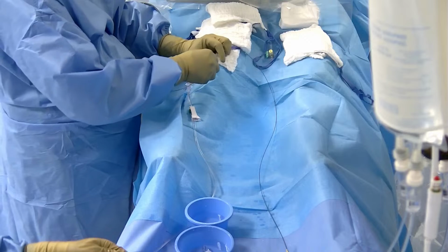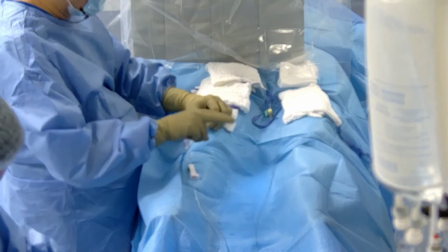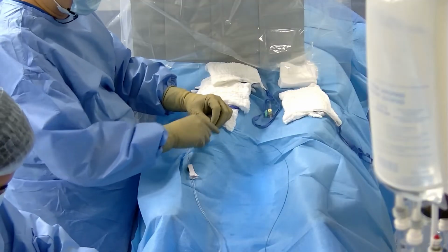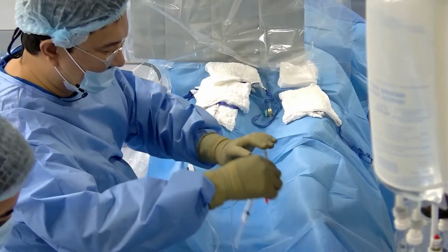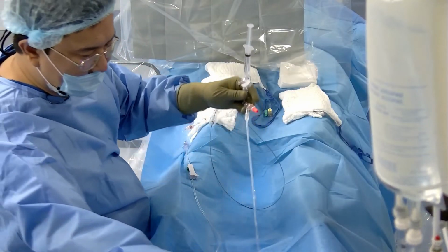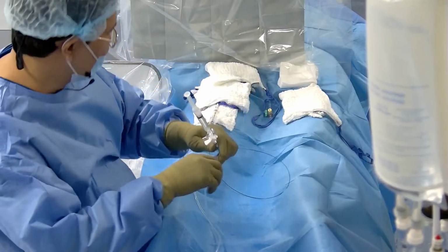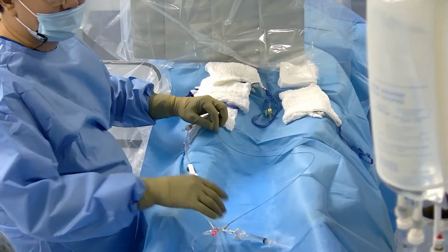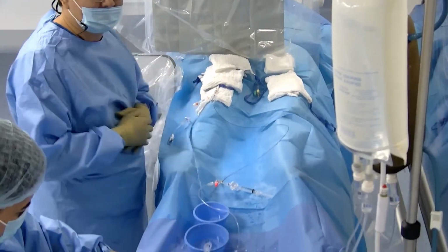It was just one of the first cases of Scepter in my country 12, 13 years ago. And nowadays we are trying to teach our colleagues, and not only in Kazakhstan, also through the YouTube channel, to prepare the balloon properly.